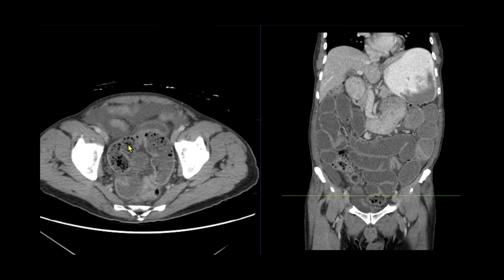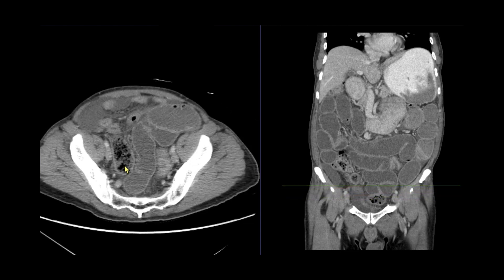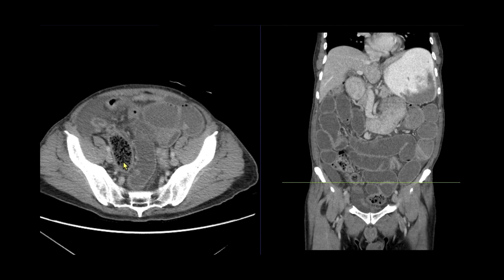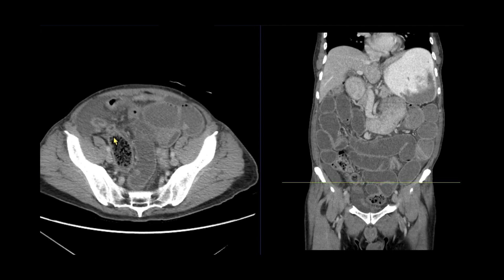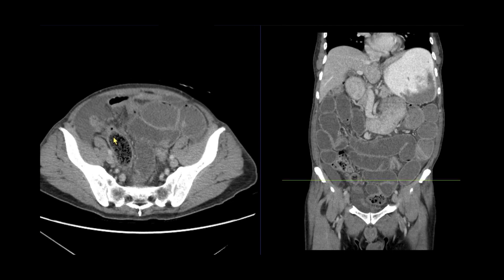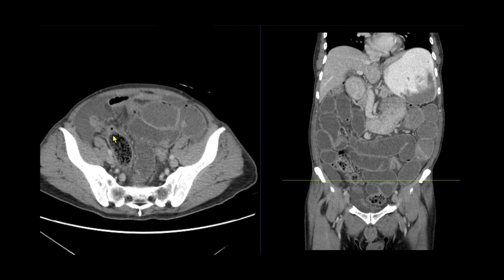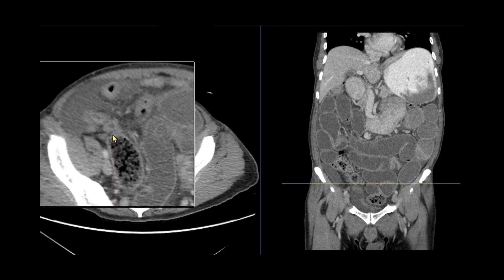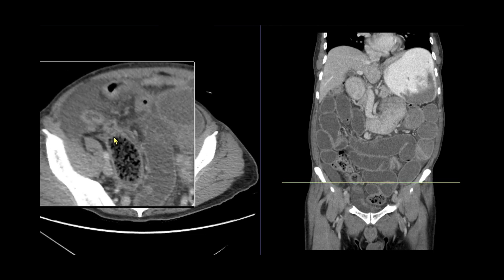Let's continue to follow this loop of fecalized small bowel and see if it leads us to the transition point. Here in the right lower quadrant, there is a transition from dilated small bowel to distal decompressed small bowel, indicating the transition point.